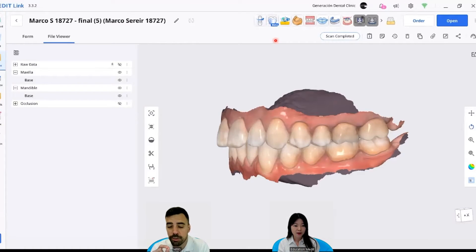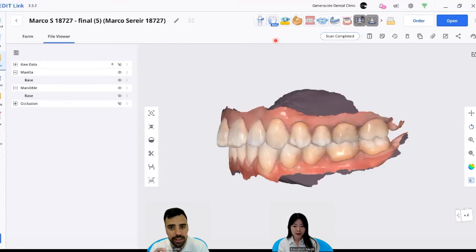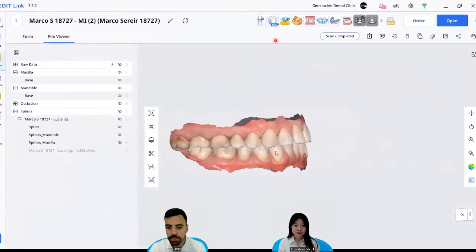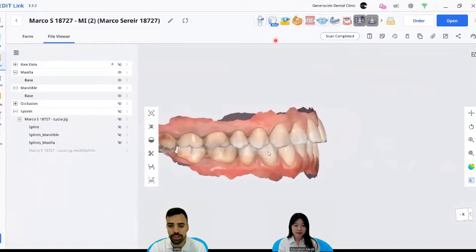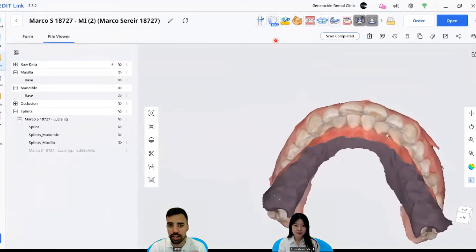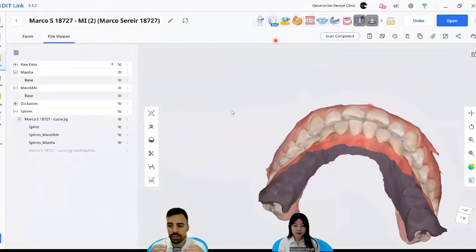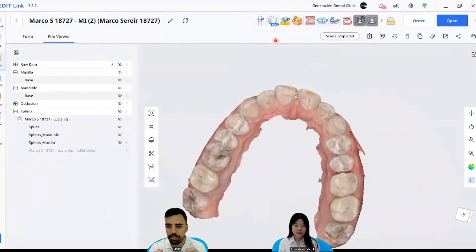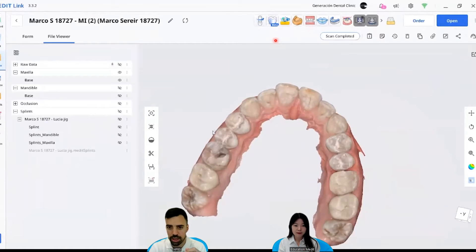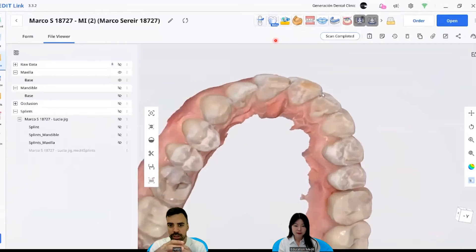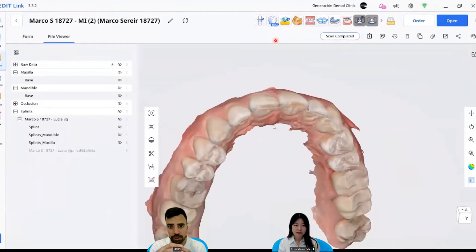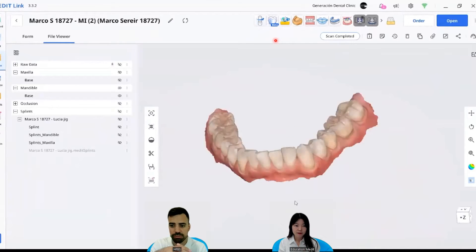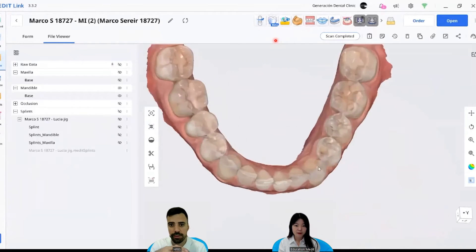Well, thanks to the deprogrammer, you can see where the bite of that patient was. So this is the patient came to the clinic. We recorded him into this position, which is maximum intercuspation, so MI. So teeth are just together.